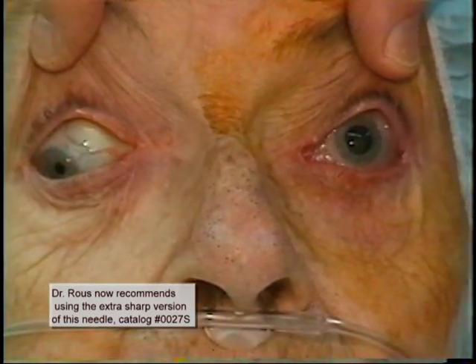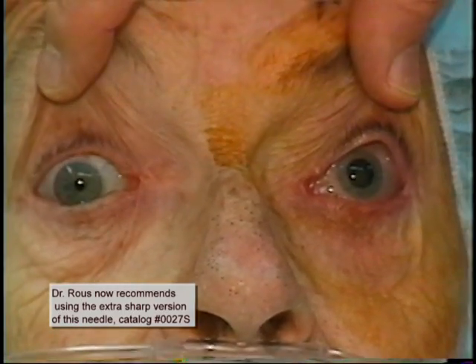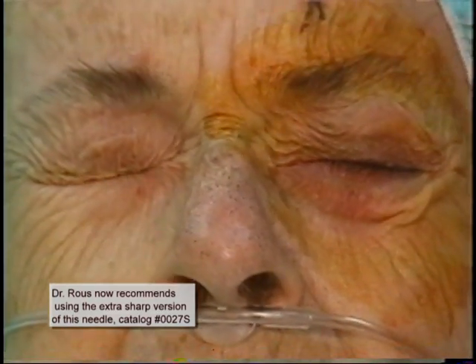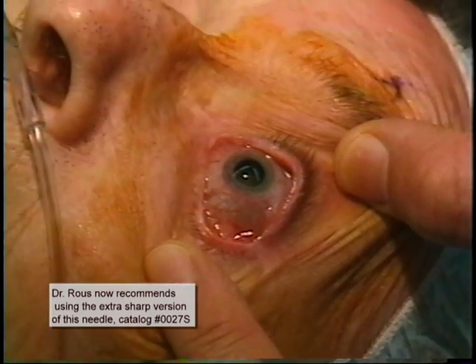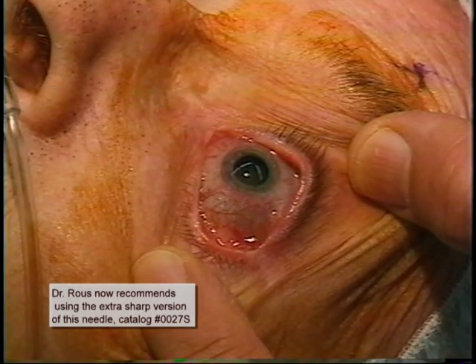The patient is now in the OR. Betadine application and the Honan's balloon and digital massage have already taken place. Again, we have excellent akinesia with no movement right, left, up, or down. Notice that only a mild amount of conjunctival chemosis remains. On close-up, with the lids widely separated, the residual chemosis is barely noticeable.